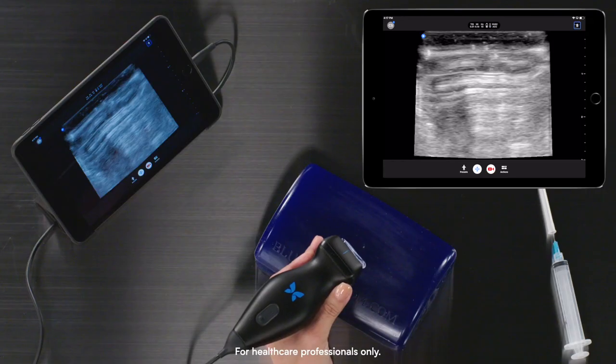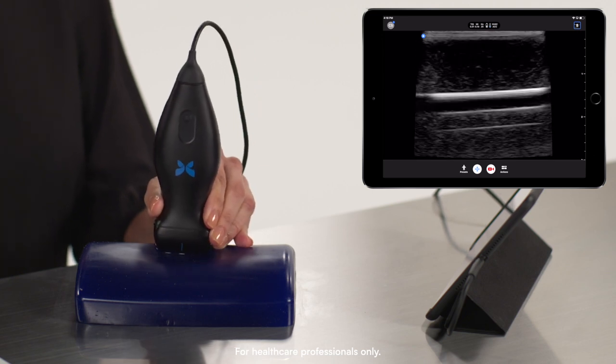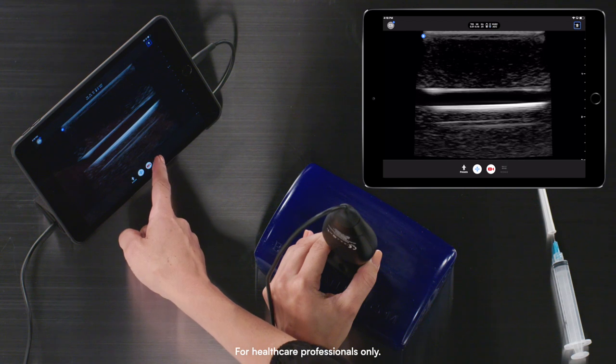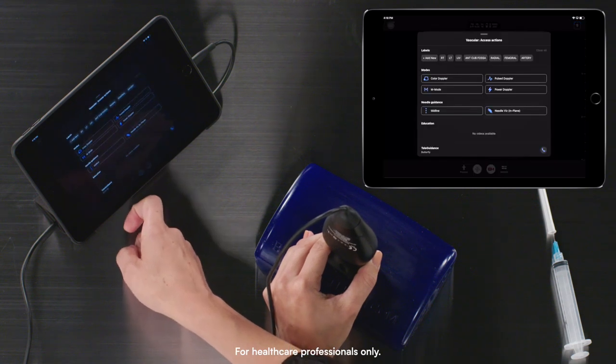For today's demonstration, I will be on the Vascular Access preset. I'll begin by finding my region of interest, and then I will select, under my Actions menu, the NeedleViz feature.